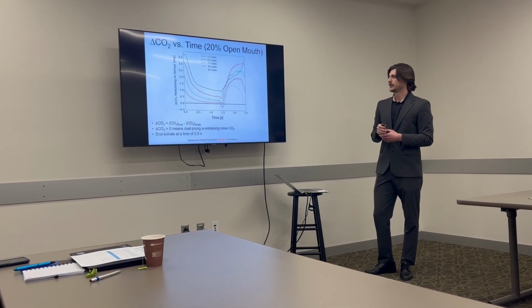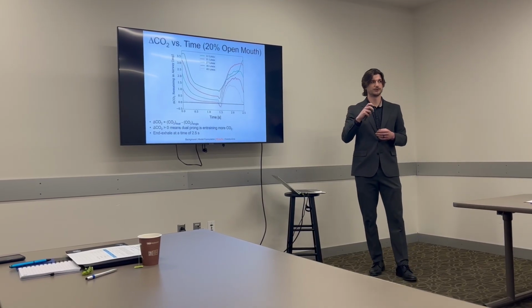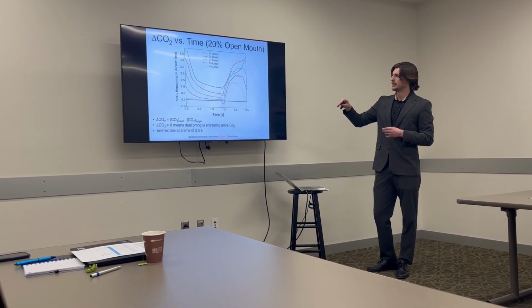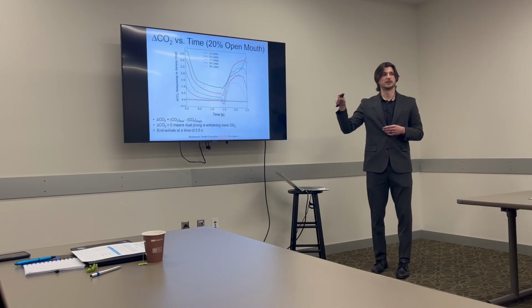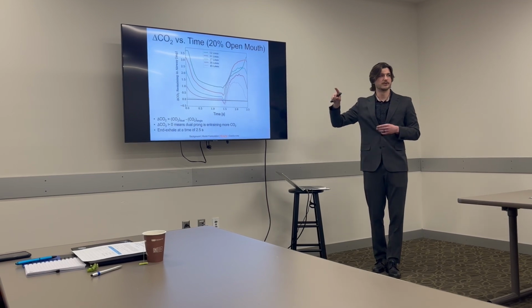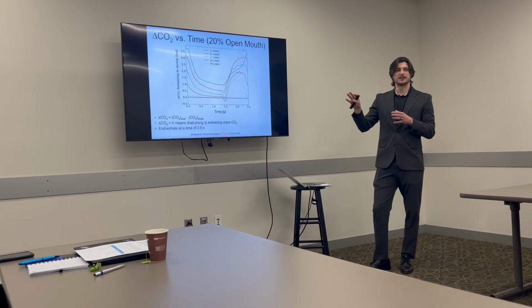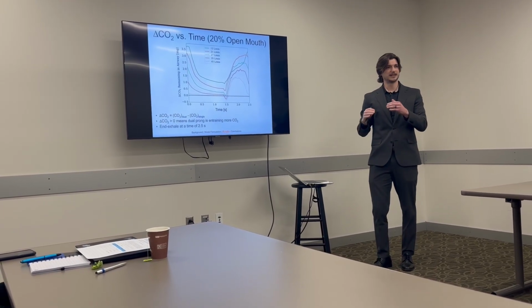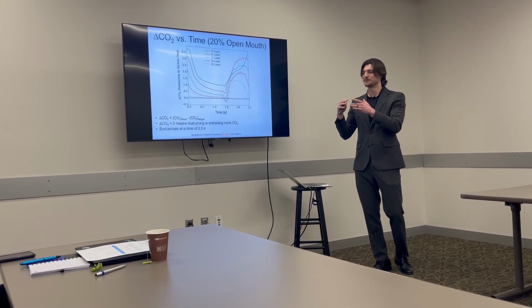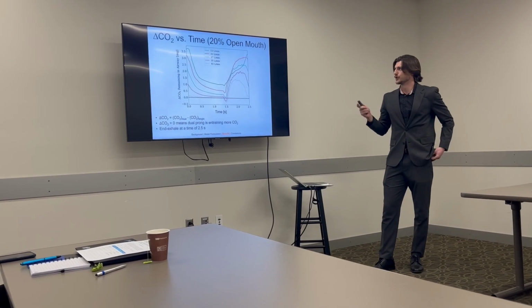Now another interesting phenomenon is the transient characteristics of the 12 liter per minute curve. We can see that for 21 through 45 liters per minute, the overall shape of the curves are very similar, whereas when we change to 12 liters per minute, we can see that it crosses over some of those signals. It has a much different shape than the higher flow rates. So this is something that we think might warrant some future investigation, filling in the gaps between 12 and 21 liters per minute and seeing if we could find out more about that changing transient characteristic for that 12 liter per minute curve.